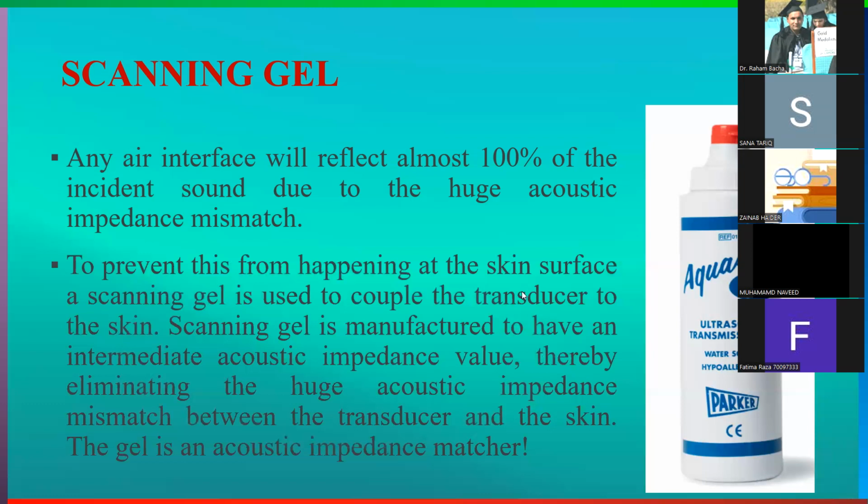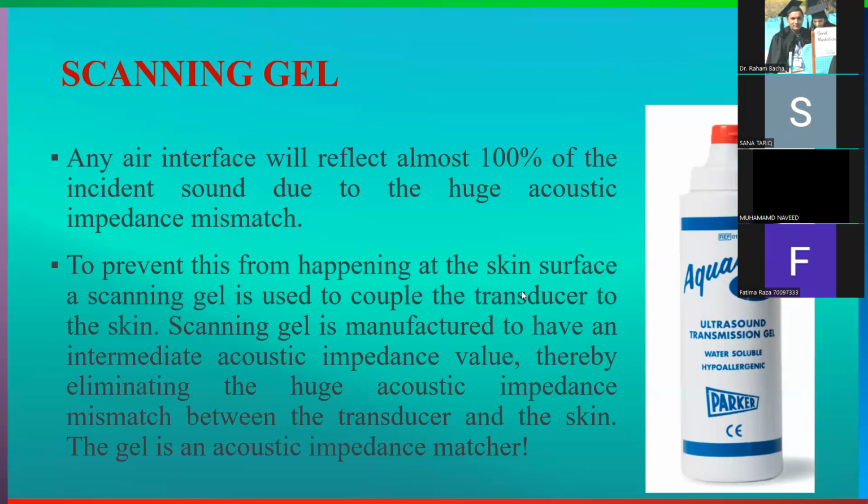For example, if you are asked in an interview or by anyone why we are using acoustic gel, the acoustic gel is used to reduce the acoustic impedance mismatch. It is used to improve the ITC and to reduce the IRC, right?